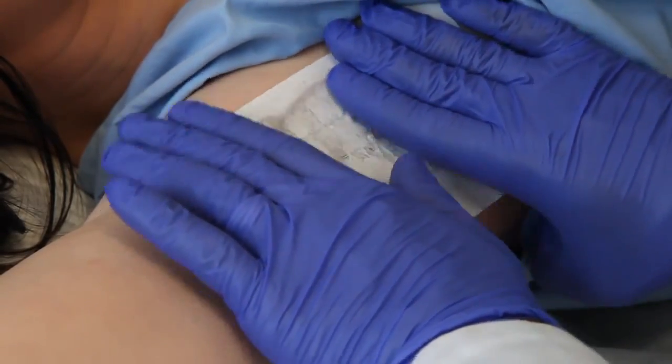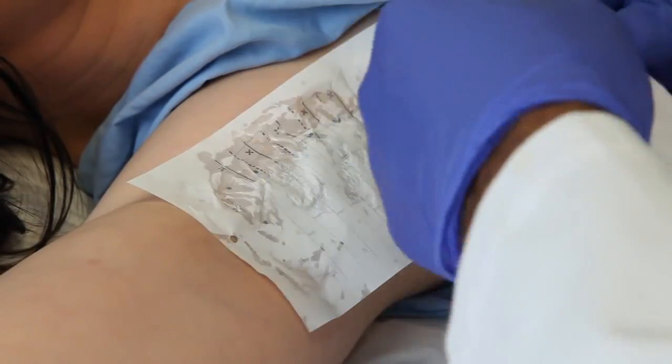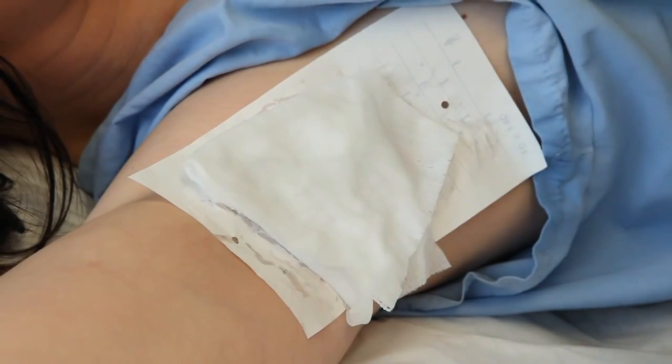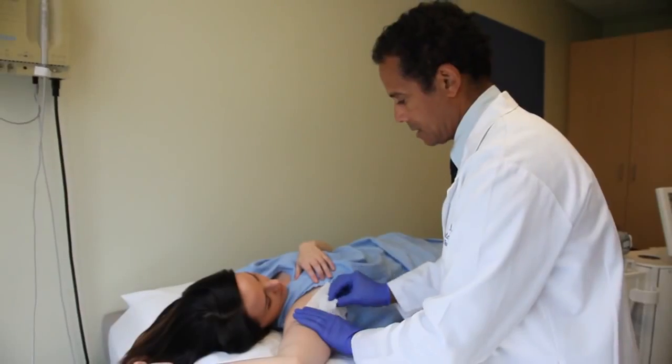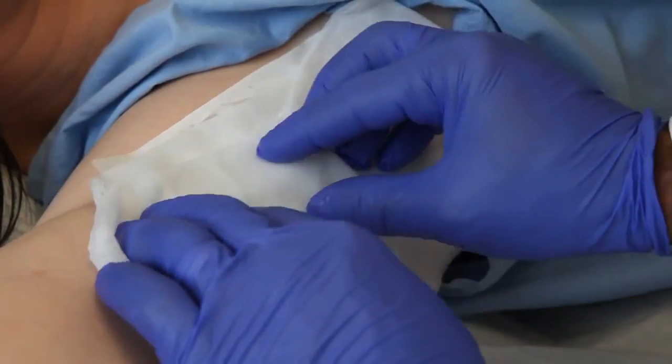We put that template over the armpit area where you have the greatest amount of sweating, which is essentially the part of the arm that has hair follicles, because hair follicles are very intimately associated with the sweat glands.